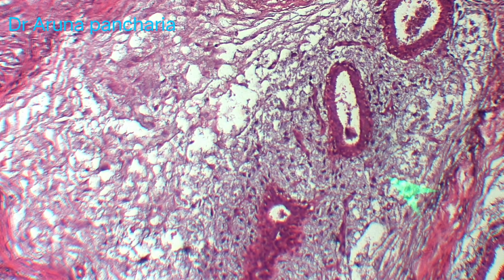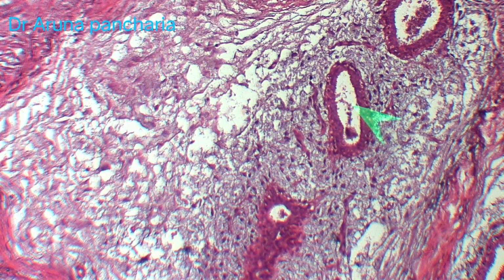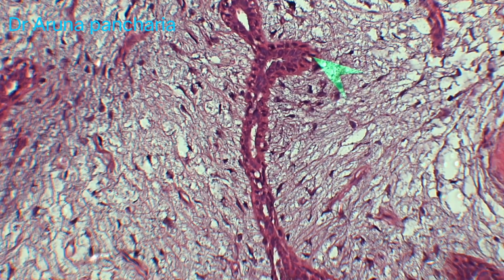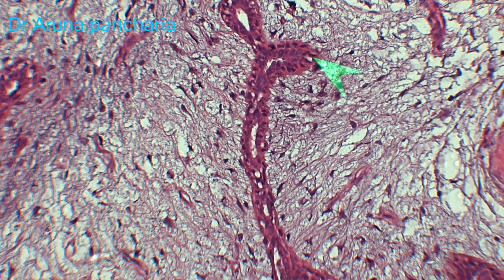So the stromal overgrowth is in such a way that it encircles the gland. So the open and dilated glands are there. This is called pericanalicular pattern. On more high power, you have to see the bilayered epithelium, which is the most important key finding. It is a benign tumor, so the epithelium is bilayered.